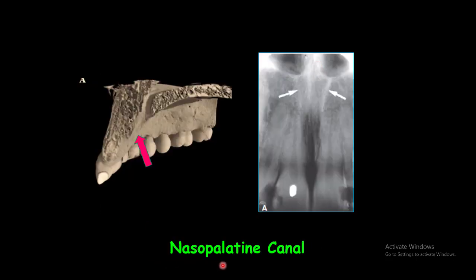The nasopalatine canal. The nasopalatine canal originates in the anterior floor of the nasal cavity and exits on the anterior part of the maxilla as the incisive foramen. On intraoral radiographs, the nasopalatine canals are seen as a pair of radiopaque lines running vertically from the floor of the nasal aperture to the incisive foramen.